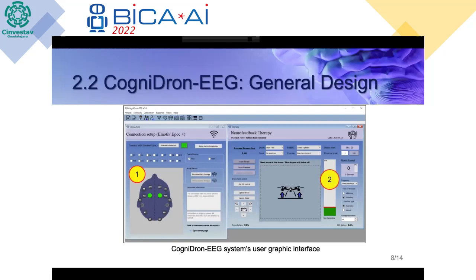On the right side of the interface there is a green button and a red bar. The red bar represents the goal set by the therapist, which can be manually or automatically set by the system. It represents the brain activity of the patient and the signals transmitted from the headset to the software. Whenever the patient achieves the red bar, a sound is played to let them know they are doing well.